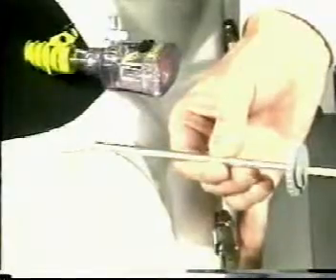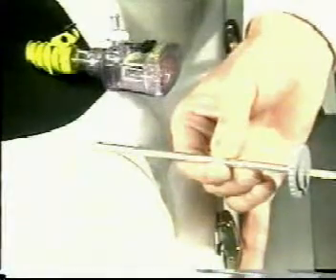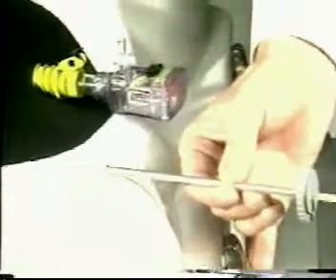Remove the excised segment. Now practice with a clip applicator and insert clips onto one of the limbs. Then divide between them. Once this has been done, practice using the endoloop by inserting it into an introducer, which is then passed through the 5mm port.